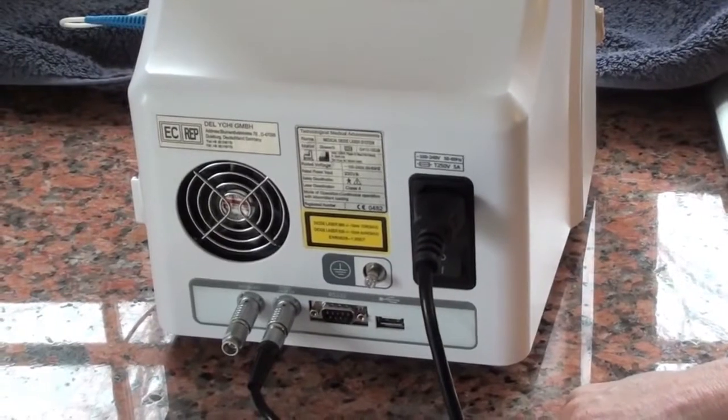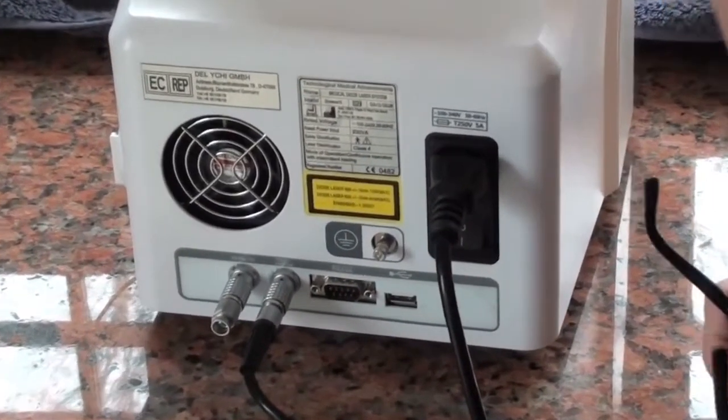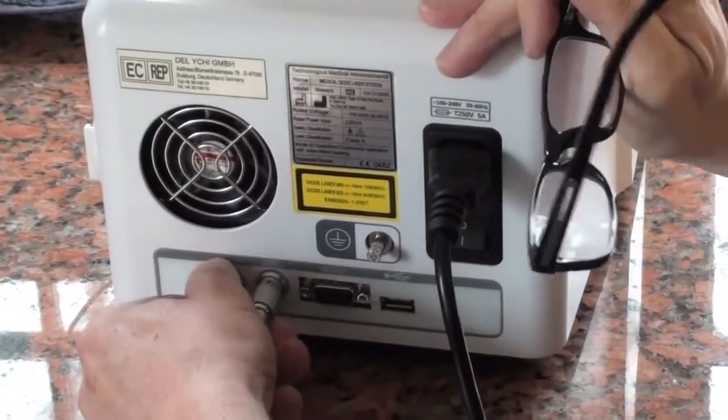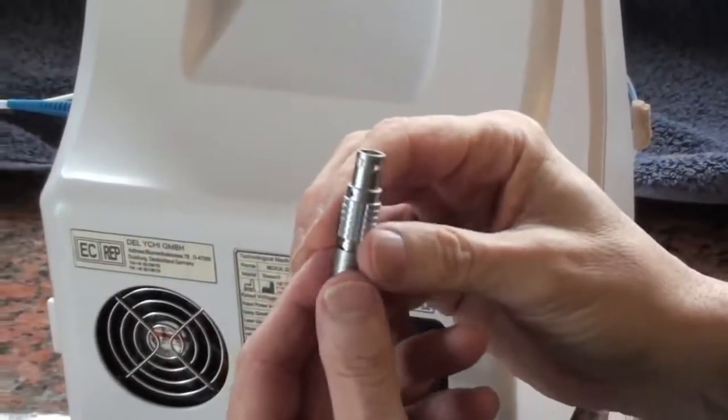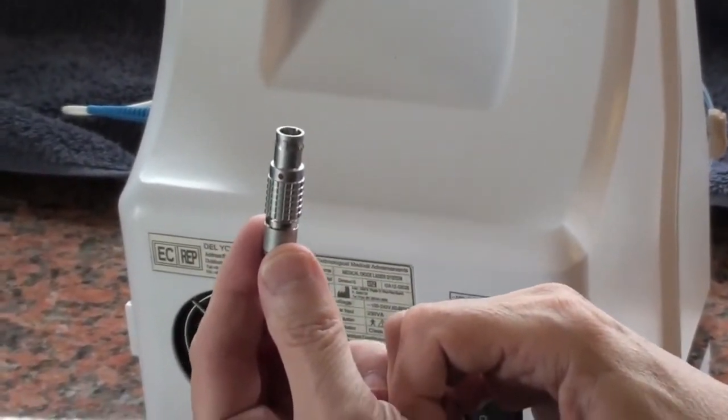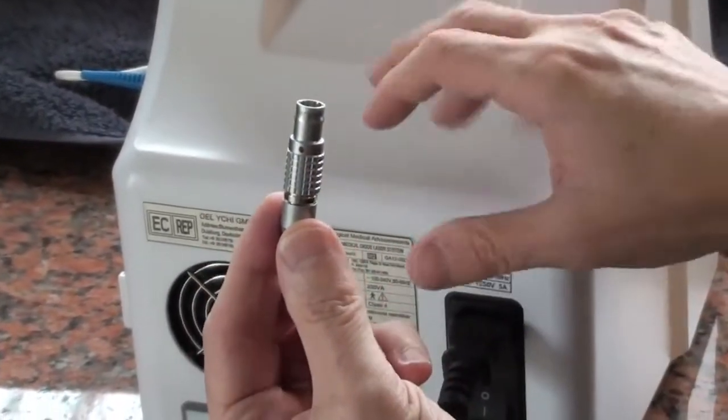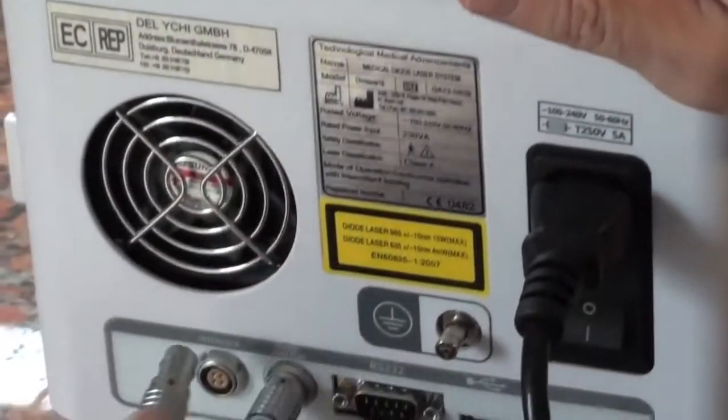The first thing we do is this is called the interlock, and the interlock is the key to the laser. Without this you cannot operate the laser. When you plug anything into this unit it must be turned off, and two, you put it in gently. You never force anything.